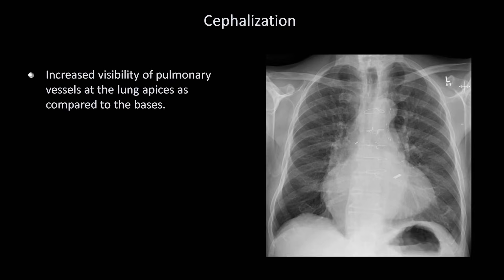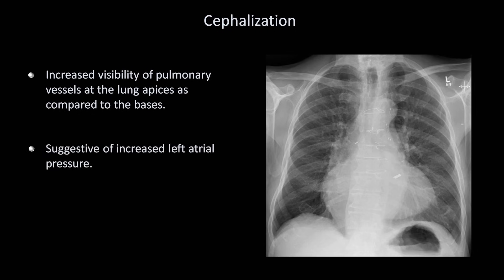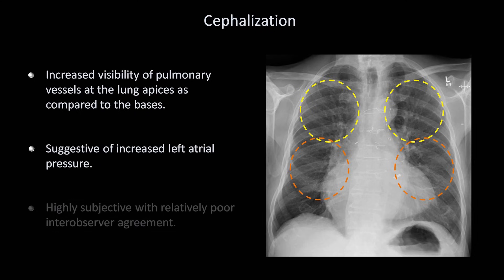The term cephalization refers to increased visibility of pulmonary vessels at the lung apices as compared to the bases, and is suggestive of increased left atrial pressure. In this example, if we compare the average density of the pulmonary vessels in the apices to the mid-lung zones, we can see that they are more prominent in the apices. Unfortunately, cephalization is highly subjective and has relatively poor inter-observer agreement, limiting its utility as a radiographic distinguishing feature of pulmonary edema.